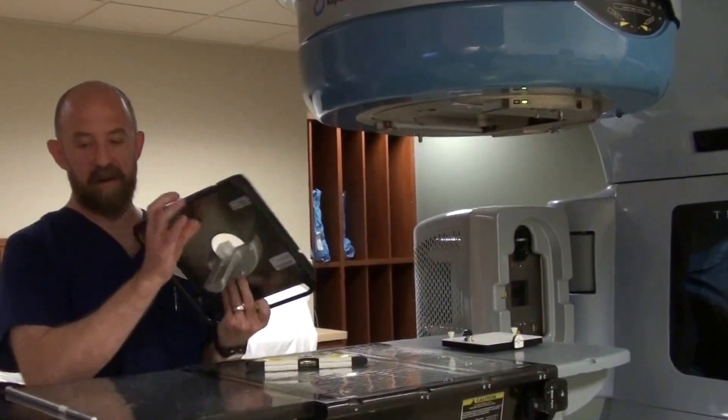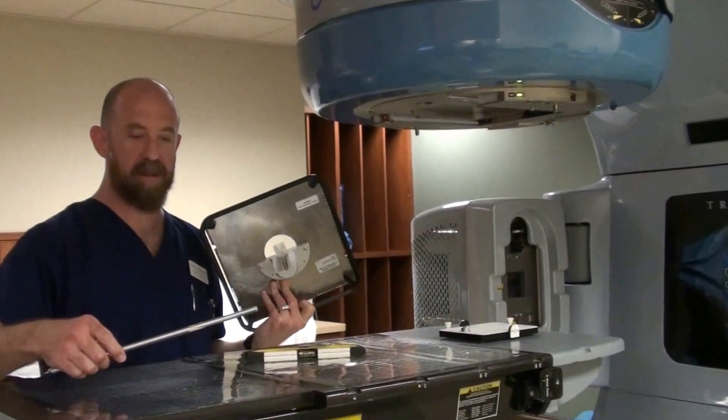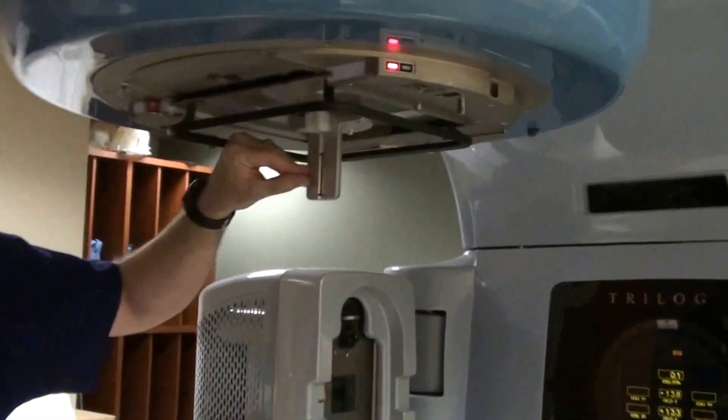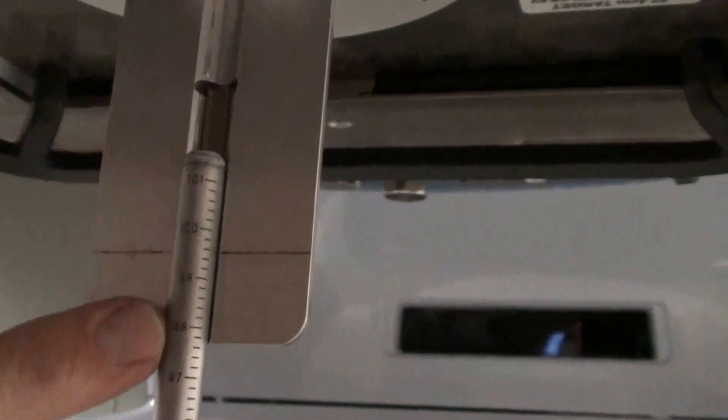We're going to take our mechanical front pointer. It's a plate with a stick that has graduated numbers on it. It slides in right where the wedge goes in. There's a little line on here etched in place. This is magnetized — we're going to put our stick right there. And you may be able to see that we have 101, 100, 99, 98, etc.